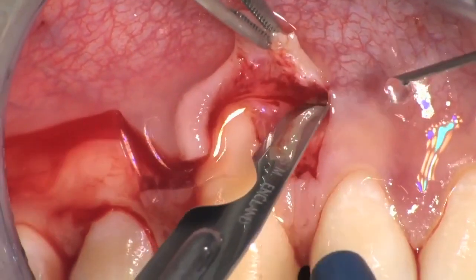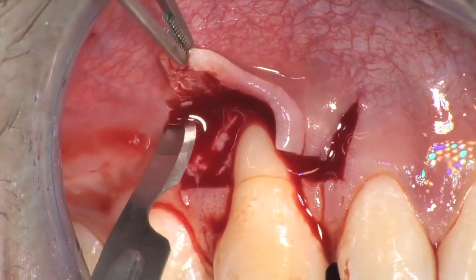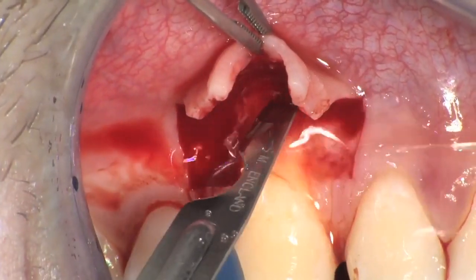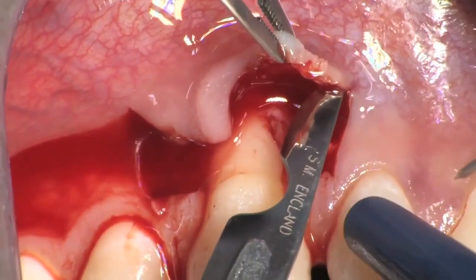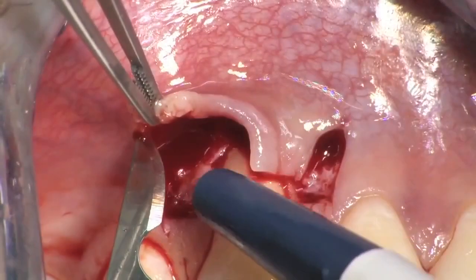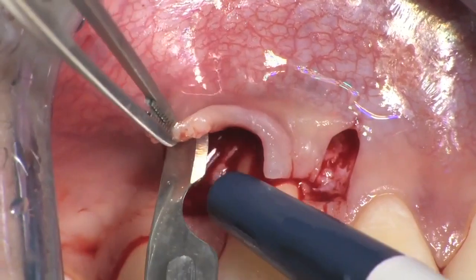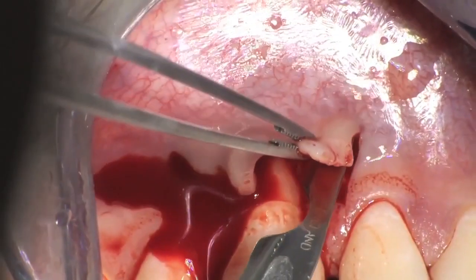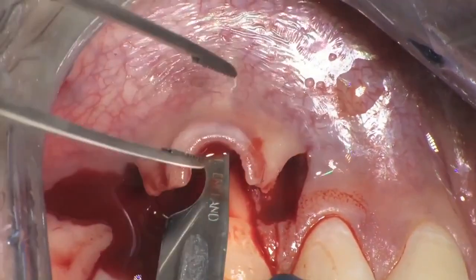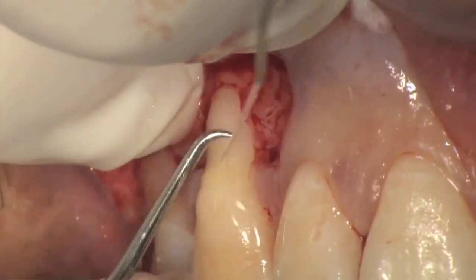Next, perform deep incisions in the lateral areas of the flap, with the blade parallel to the bone, detaching the muscles of the alveolar mucosa from the periosteum, thus leaving the periosteum to protect the underlying bone. Once the alveolar mucosa is completely detached from the periosteum, the inclination of the blade is changed and the whole extension of the blade is used to go in apical direction, keeping it parallel to the alveolar mucosa. These incisions, called the superficial incisions, are necessary in order to detach the muscles from the alveolar mucosa to allow for the advancement of the flap.